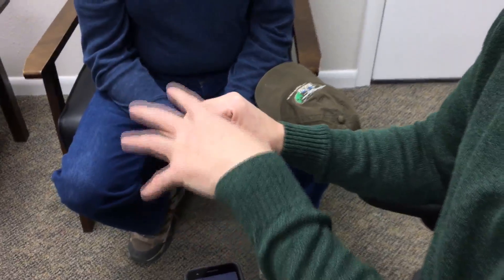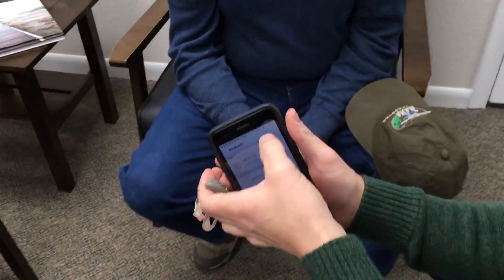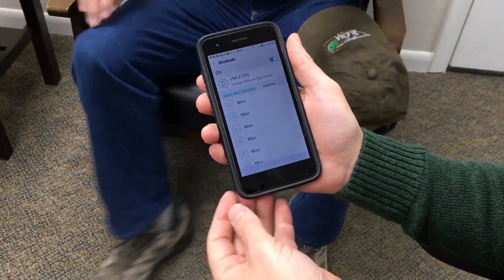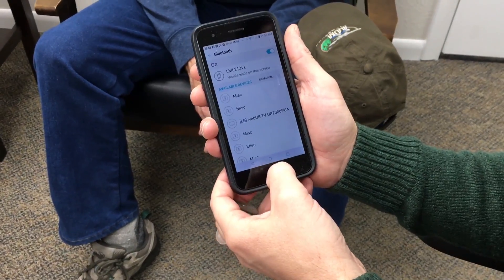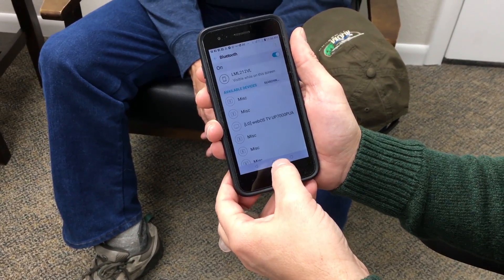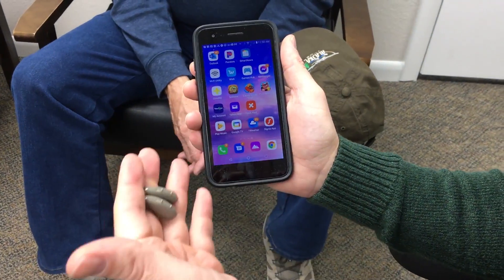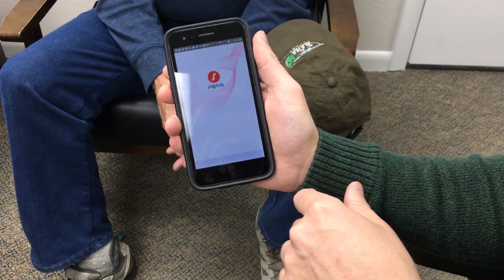You can also put them in your charger, give them a second to start the charge cycle, and then take them off. They'll restart. We've got about three minutes where they're in pairing mode. I'm on his Bluetooth tab and I'm going to hit refresh. It's going to look for devices and it's finding a whole bunch of stuff. There are a lot of different Android protocols, so I'm going to try to do this through the app first.